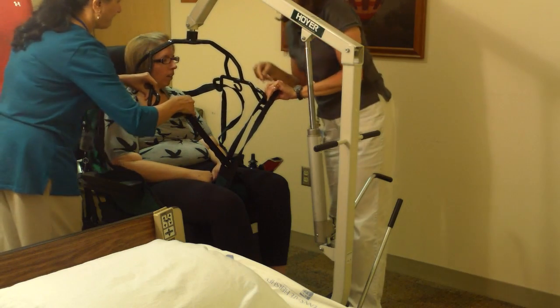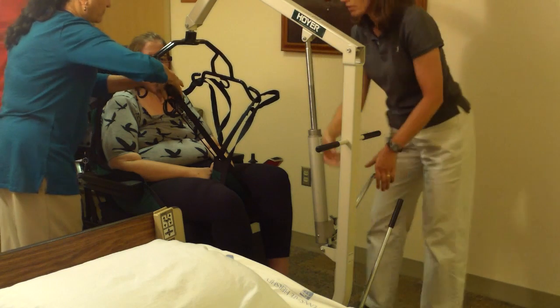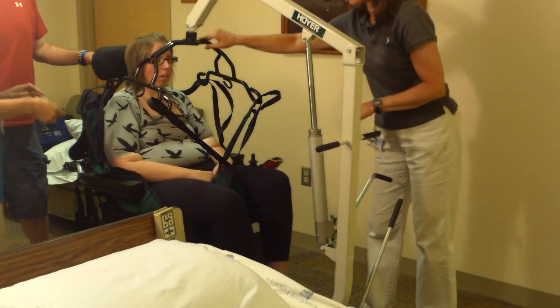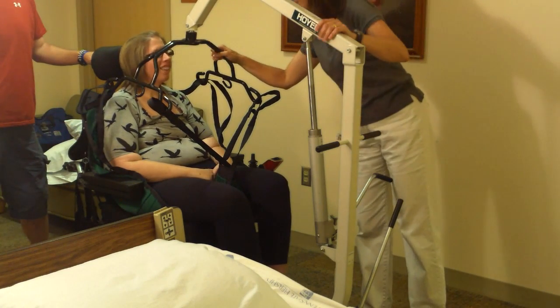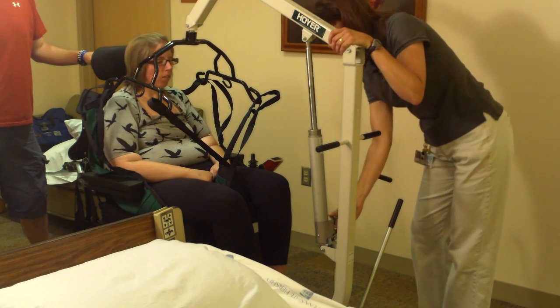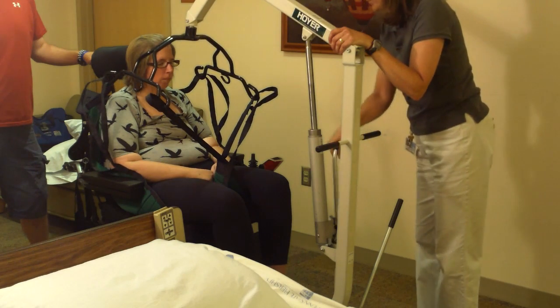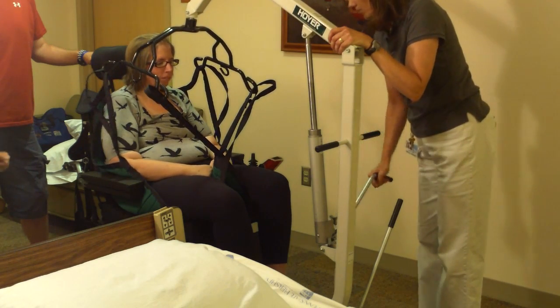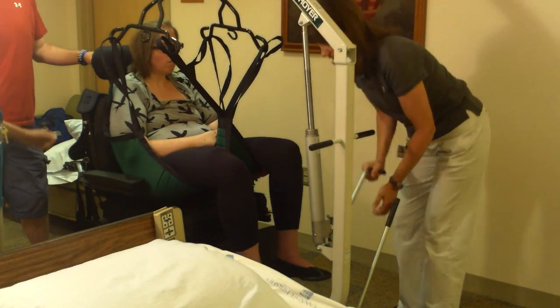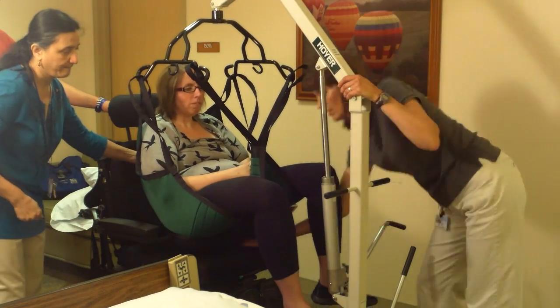You then need to put the loops on to the mechanism. Make sure you have the same set of loops on. And the patient feels secure. Make sure the knob is tight. And you can start pumping so that the patient is lifted out of the wheelchair.